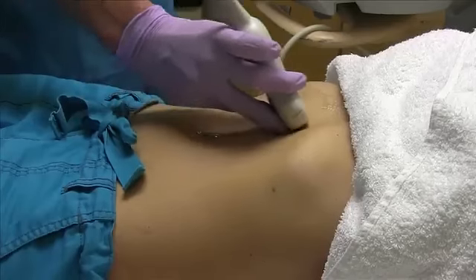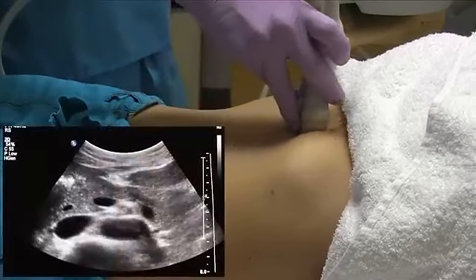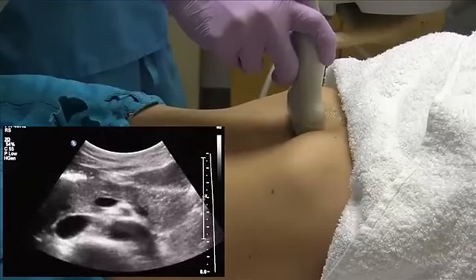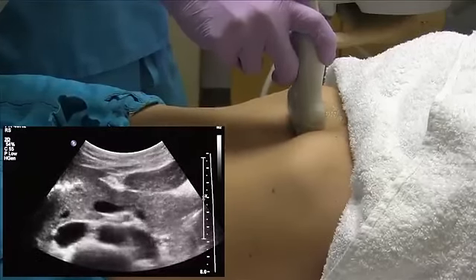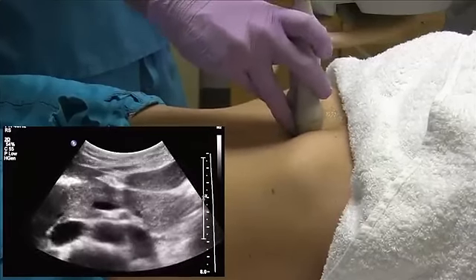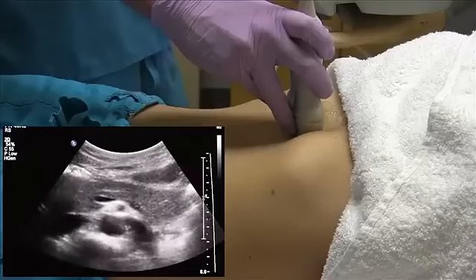So we're going to come up high, angle down, and the other key is you want to oblique your transducer slightly counterclockwise. This will set you up for a nice sagittal pancreas image.